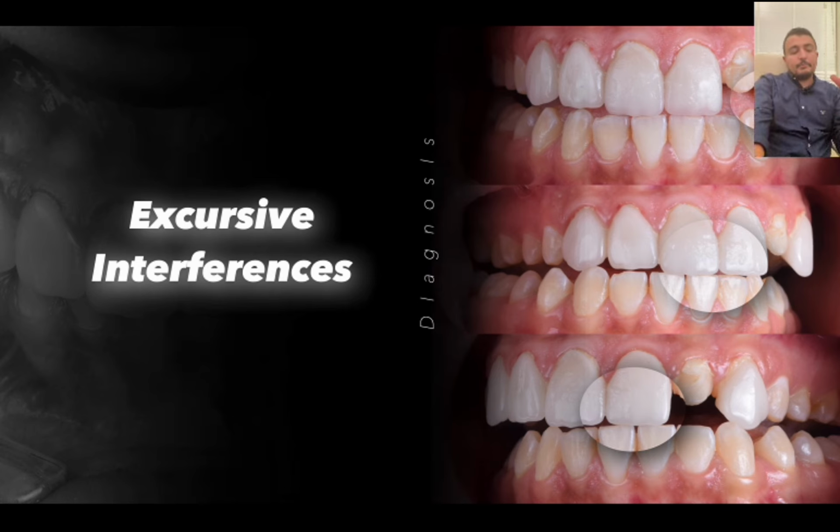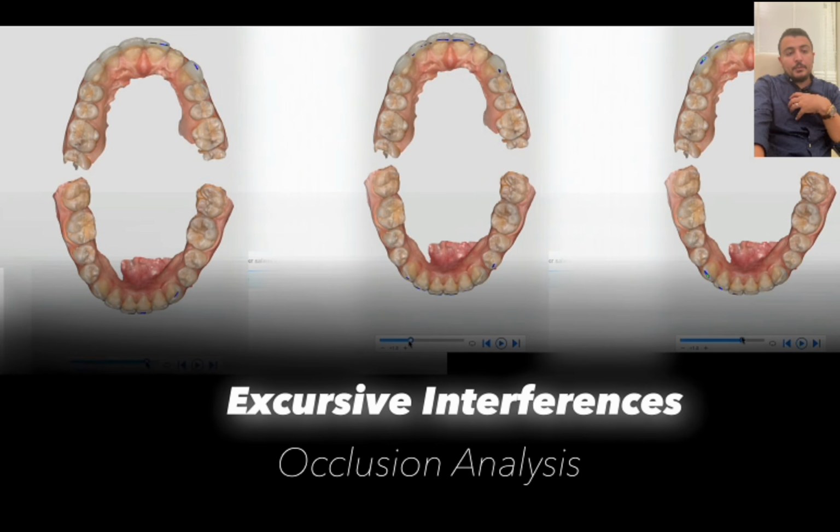So one of the primary requirements for this treatment is to achieve a proper occlusion without any interferences in protrusive and lateral movement. So usually my protocol is to start with a proper diagnosis for such cases to be able to reach the ideal outcome. So using the scanner and jaw motion software from Medit, we can here also analyze the patient movement, protrusive and lateral movement. So we can see a lot of interferences regarding the protrusive movement and also the lateral movement.